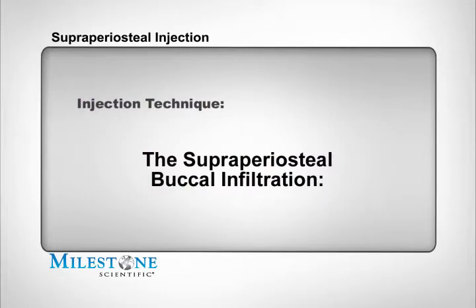The STA system is ideally suited for the administration of traditional injections like the buccal infiltration as well as the posterior superior alveolar nerve block. Let's discuss how to begin. Injection technique: the supraperiosteal buccal infiltration.